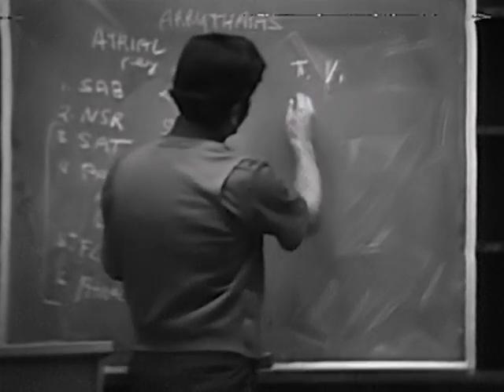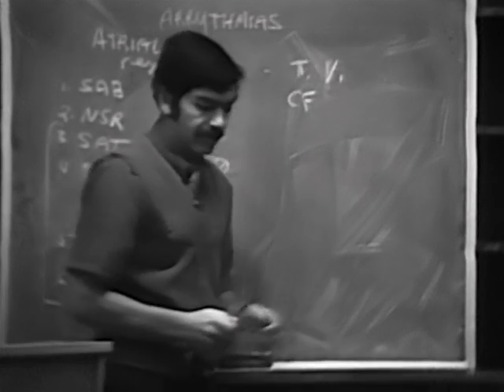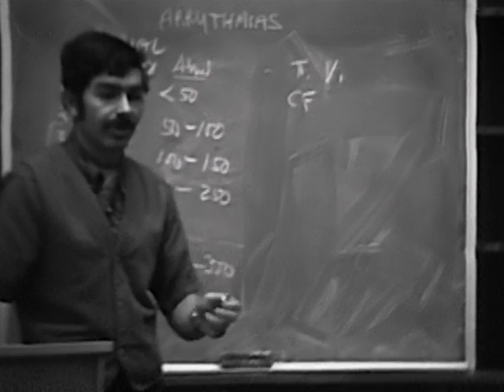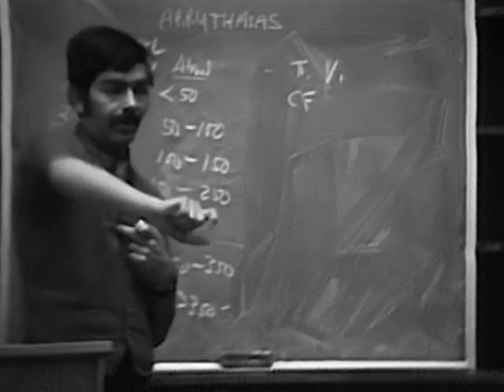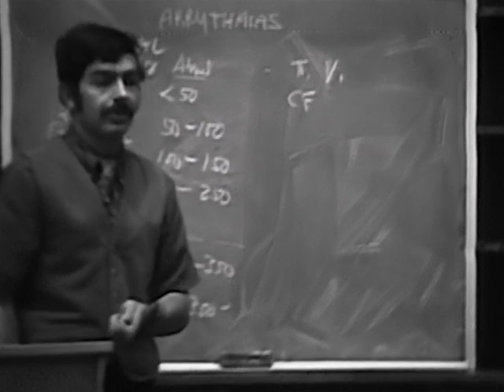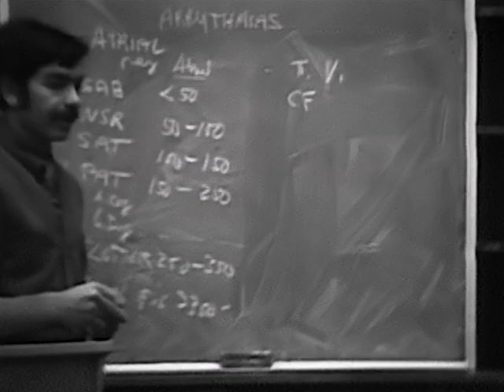Now, some other leads that are good to take. There's a CF lead, which if you have some of these old type of electrocardiograms, they have a CR, CL, CF. And in a CF, what you do is you put the electrode in the V1 position, and you dial all the way around to CF. And it's getting the difference between chest to foot, the CF lead. Okay, so you can try that one if your machine has a capability of doing that.